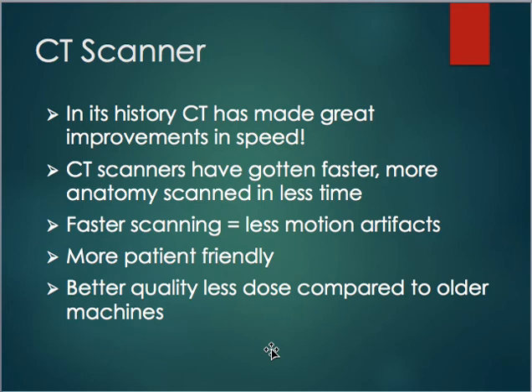Those earlier ones could collect up to 4 slices of data in about 350 milliseconds. And then they could reconstruct the data in less than 1 second. So there were huge improvements in speed. Going back to 8 hours originally, now we're at about 1 second for reconstructing data instead of a whole day. So going through now, an entire chest CT can be scanned in 5 to 10 seconds.